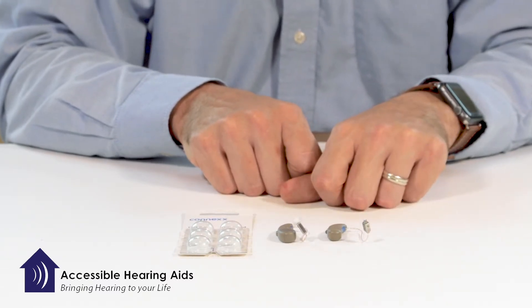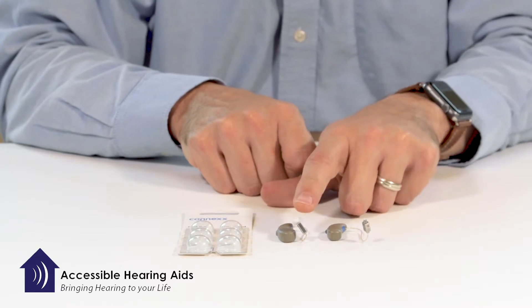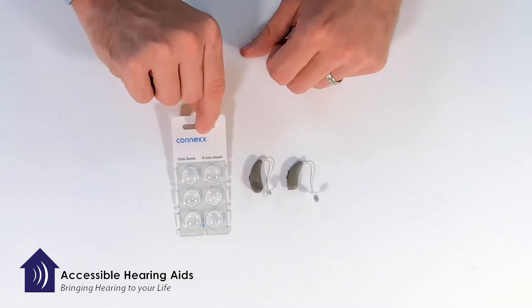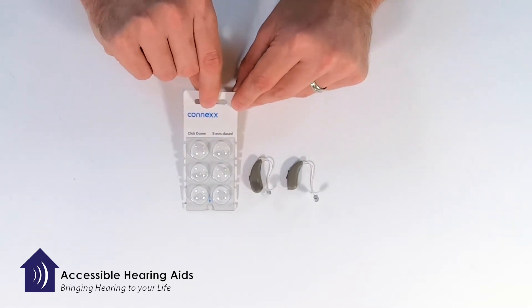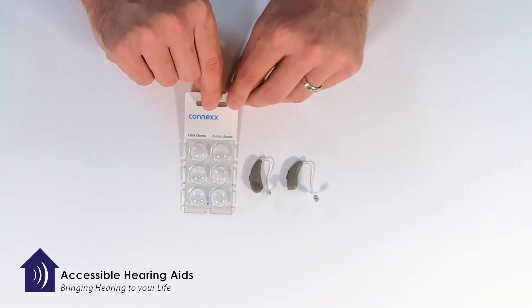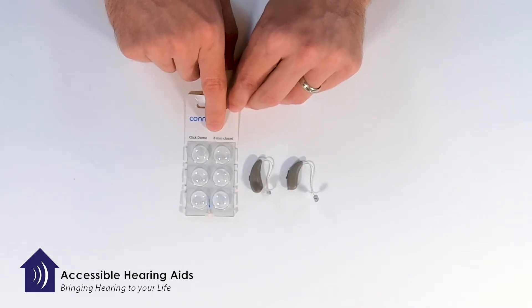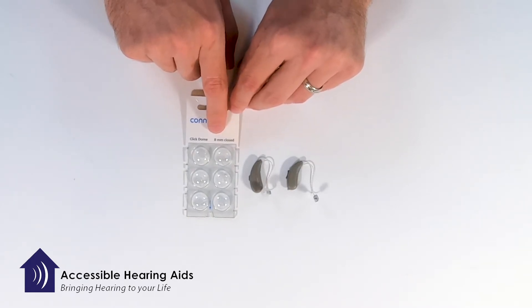I wanted to show you how you actually replace this tip. You have your extra tips here - they should be included when you receive hearing devices from your hearing professional. There are different sizes. This happens to be an 8 millimeter closed. There are also 6 and 10 millimeter closed, and 6, 8, and 10 open. There are a couple of other types of double domes if you have more power that's required from the hearing device, but your hearing professional will discuss the type of dome that you need.